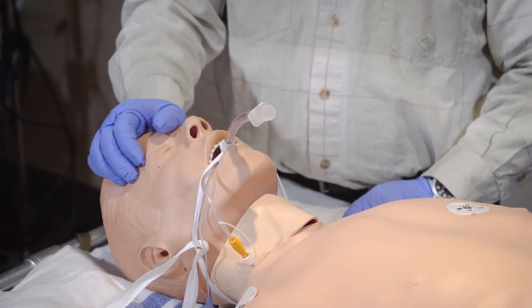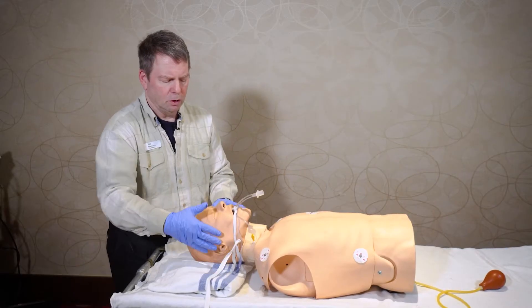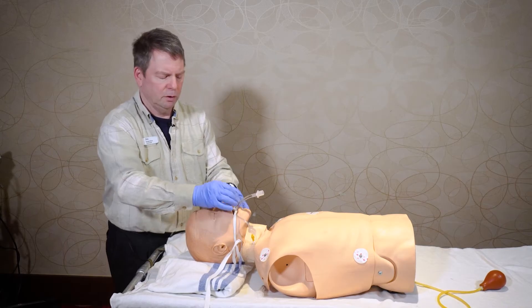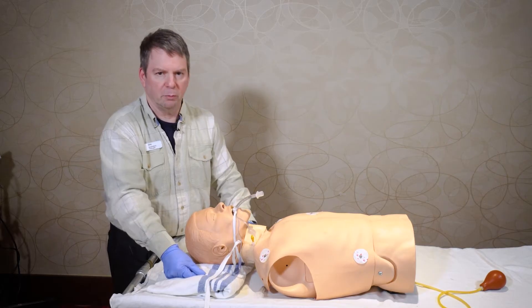Then you would double check the number that you have there, and just realize that this is actually going around the neck. If you were using a commercial device that actually glues on the face and secures it better, that would often be done subsequent to the chest x-ray after you've confirmed that the tube is in the right position.